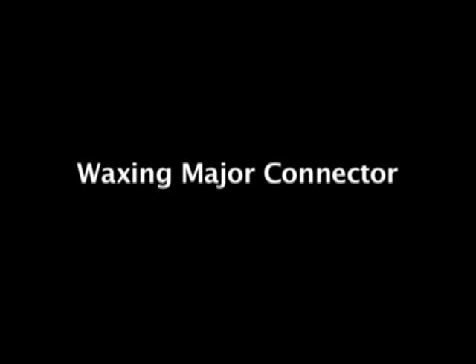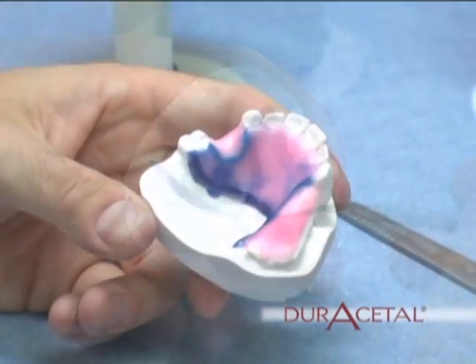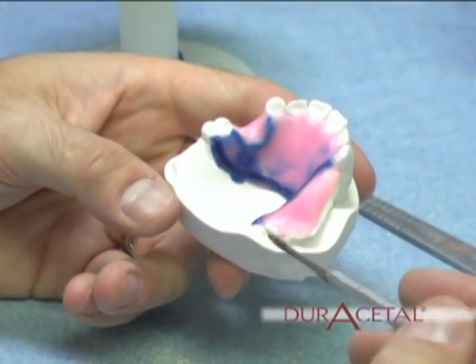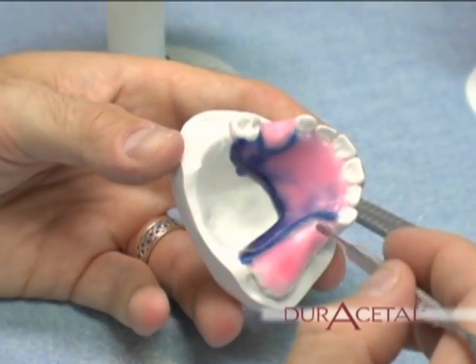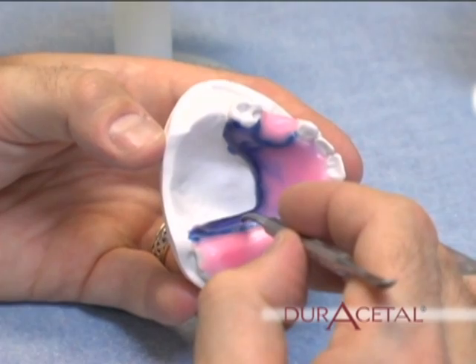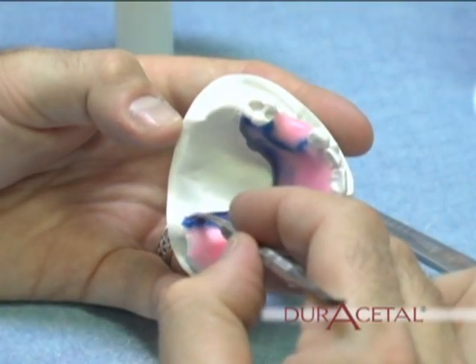Waxing the major connector. You want the thickness of the major connector to be no less than 1mm thick and no more than 3mm. Notice that the blue rope wax is still visible. Using the blue wax as a guide, now define your external finish line with no worry of overlapping the internal finish line.